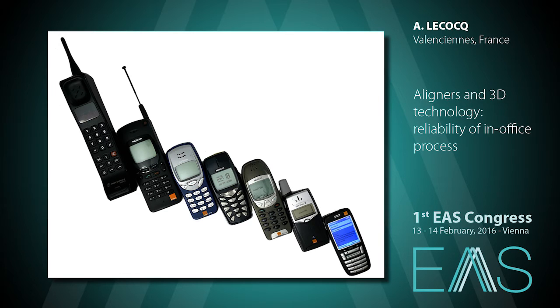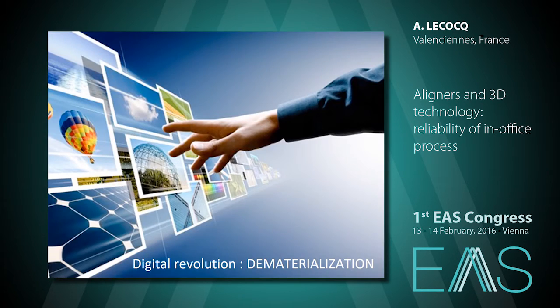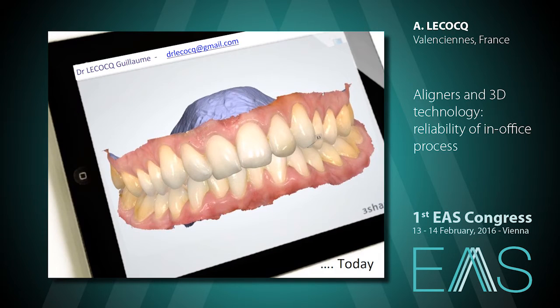Fortunately, there has been a clear progression in mobile technology, so that today you all have this kind of sophisticated smartphone with internet access and time-saving applications. We are all connected to the world from the palm of our hands. And the corollary of this digital revolution is the dematerialization. Yesterday, we used to make these kinds of impressions. Now they are becoming virtual.